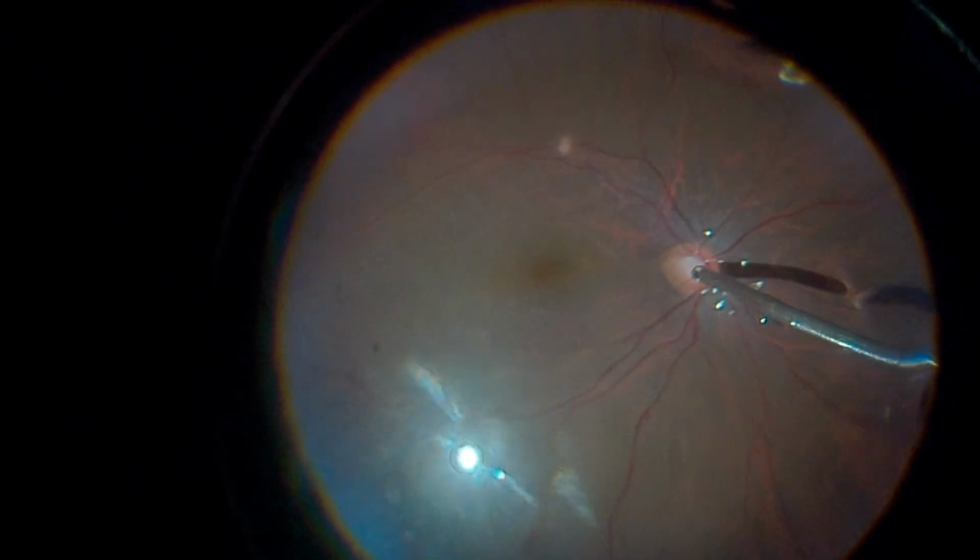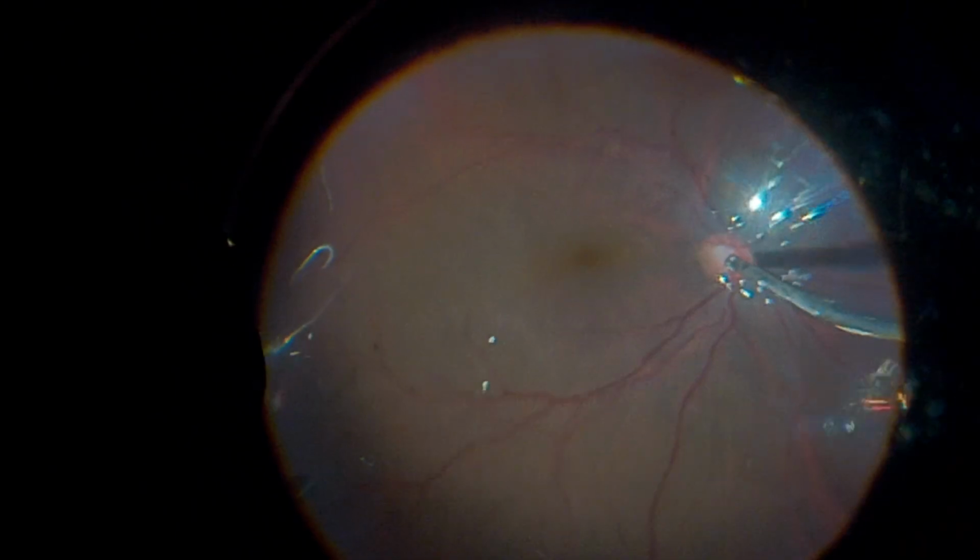After completing the shaving of the vitreous base, the surgeon performs a fluid-air exchange. Note that the eye is tilted towards the tear until all subretinal fluid is removed. After completely drying the margins of the tear, he aspirates the perfluorocarbon and applies laser around the area of the temporal tear.